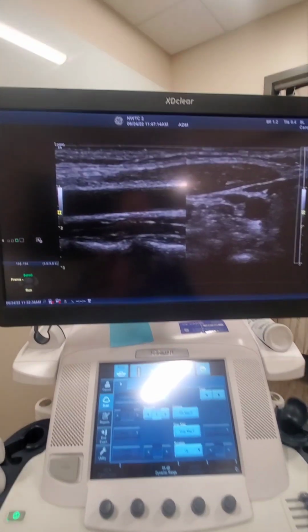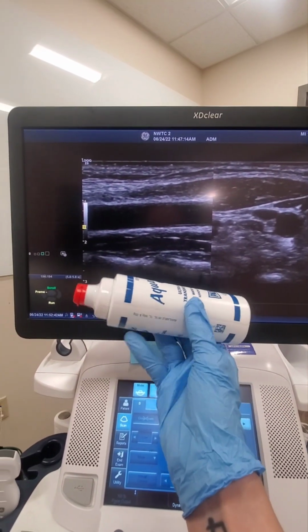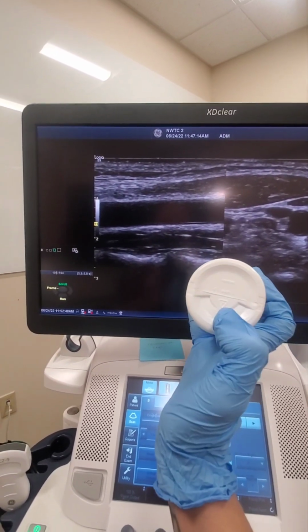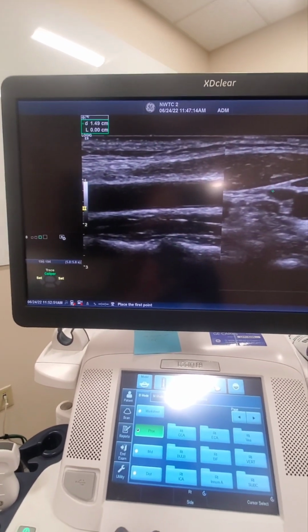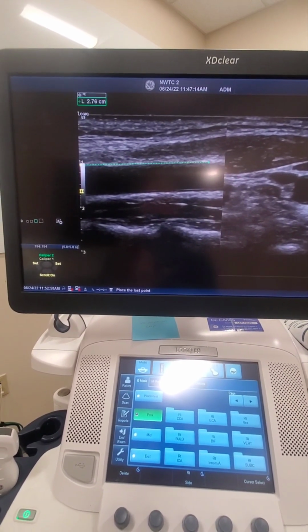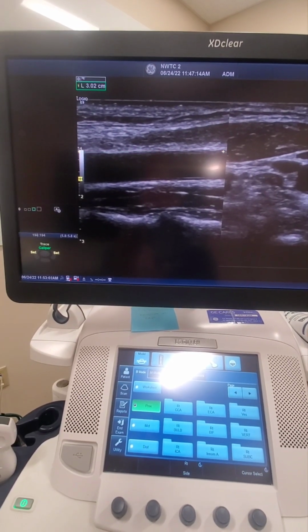So, how do these images correlate to those 3 dimensions? Where is our length, width, and height? Let's pretend like this is a carotid artery. We have length, we have width, we have height. The length of the carotid that I have imaged, it goes beyond these dimensions, but there's length.